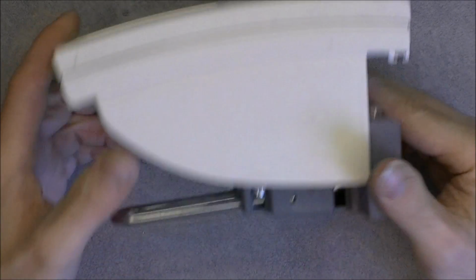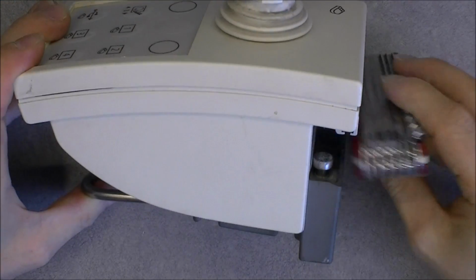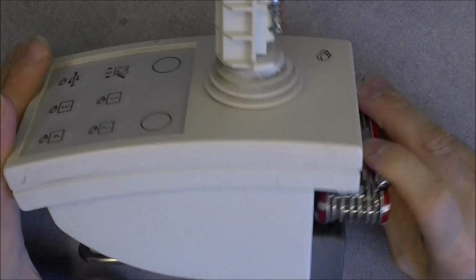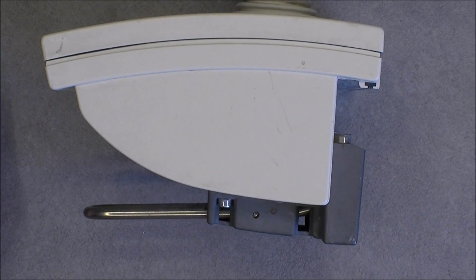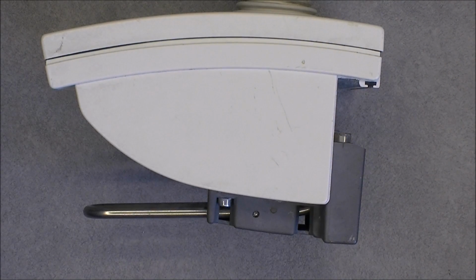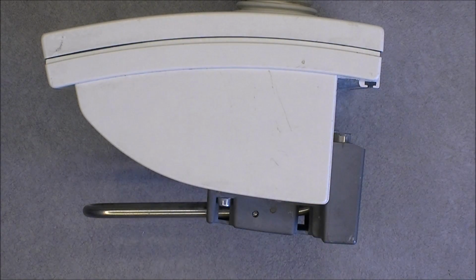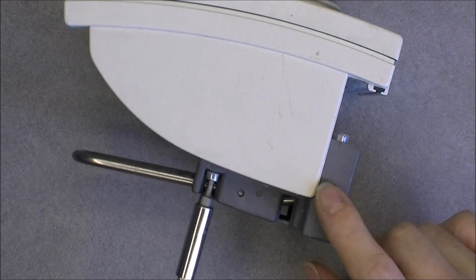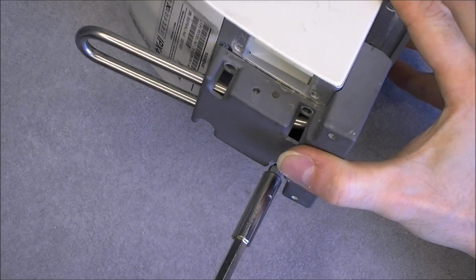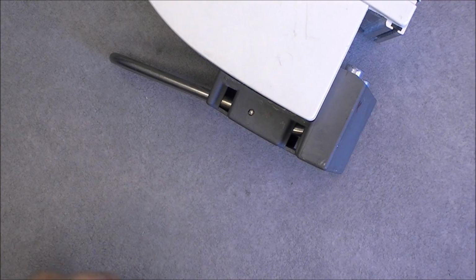Okay, so what next? We will remove this bottom extra piece. So I guess it is for securing the device on some kind of rail on the side of the X-ray table with provision for quick release. So I need to find the correct bit for it. No, I did already remove some of the screws. So on one of them there is a screw which is completely stuck, the Allen head is wounded, so I do not know how I will do to remove it.